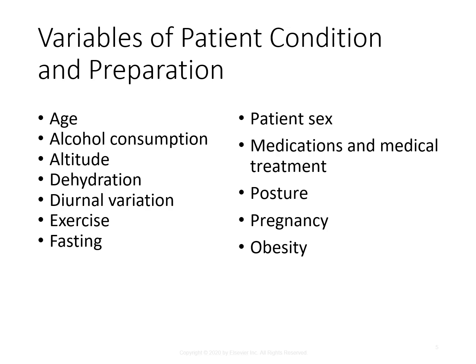The patient's physical condition at the time of collection will have a significant impact on the sample quality. Bariatric chairs should be used for outpatients, and you can use a blood pressure cuff instead of a standard tourniquet, which can also help improve access to the vein if needed.